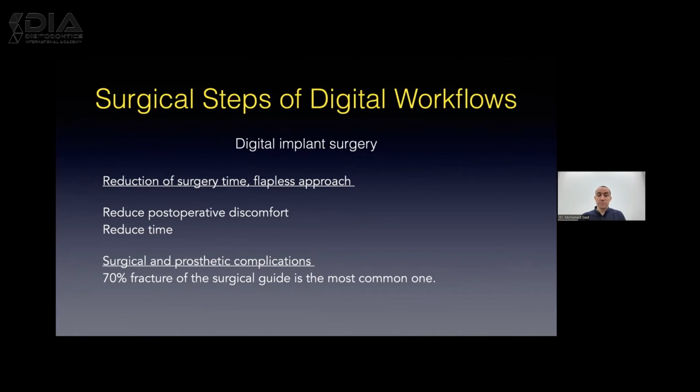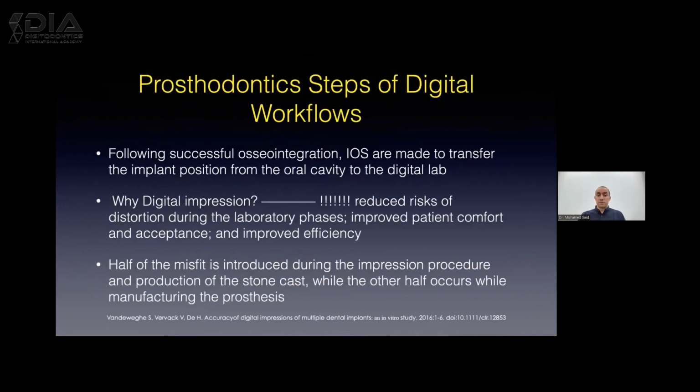It reduces the time, but it has, on the other hand, some complications, such as fracture of the guide. So we have to make sure that the guide has enough thickness to be able to manipulate it without getting it fractured. So this is one of the complications that we can encounter while we are using the surgical guide.